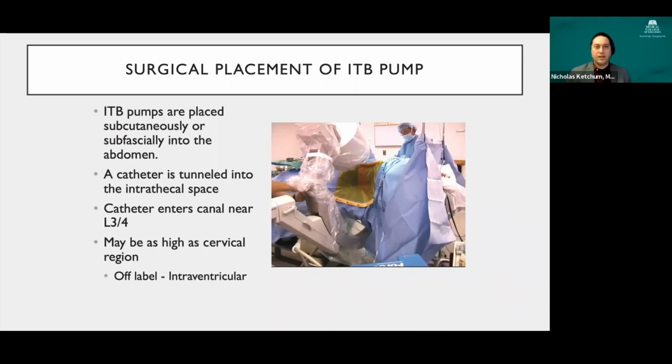In the literature, there's about a 15 to 20% or higher complication rate with intrathecal baclofen, or intrathecal pumps in general, not just baclofen. But our surgeon just recently published his method of how he has the OR set up, how his procedure is, and pre- and post-operative care. He has a much lower, I believe less than 5%, complication rate. Following his protocol, we've been able to make this a successful treatment without the high reported risk of complication.